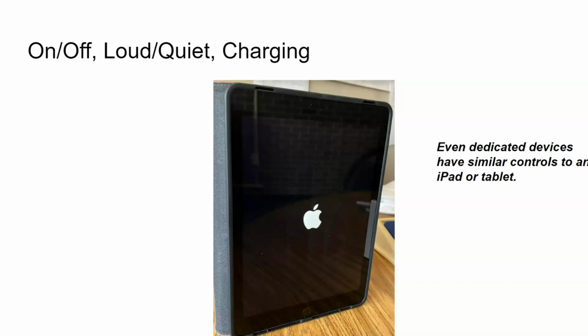Charging is just like any other tablet. Because communication devices get touched a lot and they are used for long stretches of time, they will need more frequent charging. Make sure before heading out the door in the morning that you are at full battery to give your child the best start for a day of communicating. Another option may even be getting a portable battery pack.